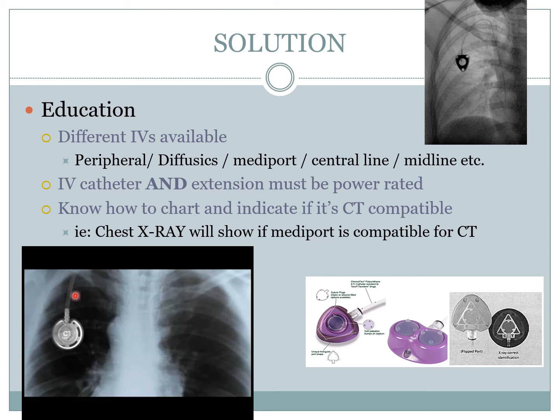So when the injection comes in, it just diffuses through the small little holes at the end of it. So it's just a faster flowing. It's not just a water hose, it's a water hose that has a lot of holes in that part.